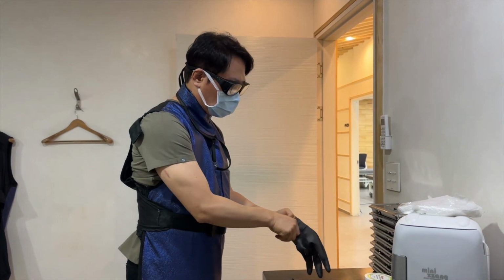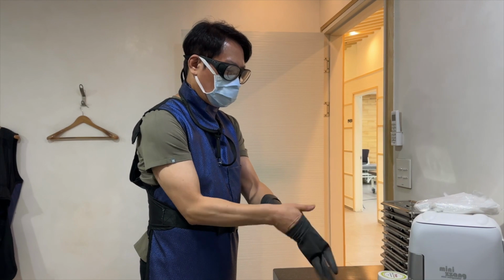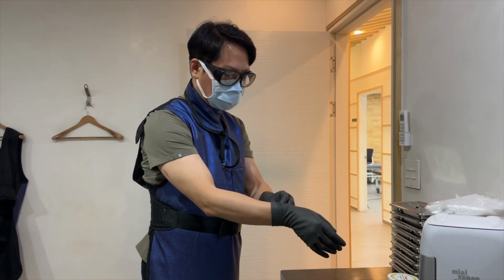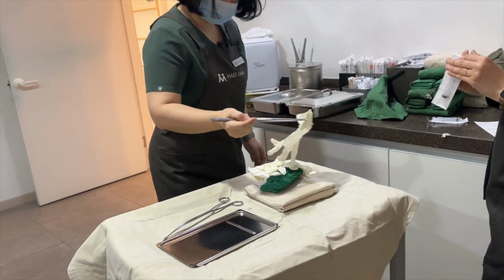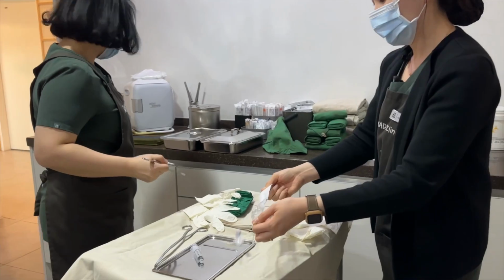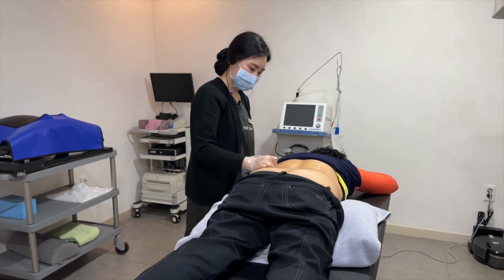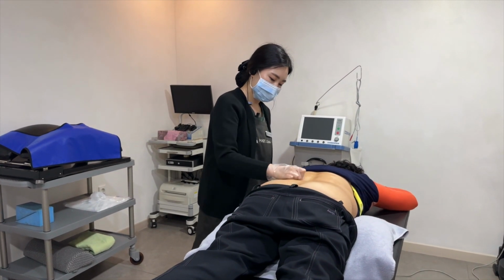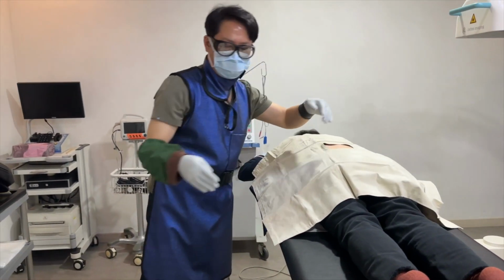It includes wearing a lead apron, lead gloves, and lead glasses. These are designed to protect the operator from radiation exposure. Finally, the maintenance of aseptic techniques is paramount to prevent infection. Operators should ensure the preparation of aseptic cloths and dressings. The surface of the surgical site should be cleaned meticulously and then dressed to maintain sterility throughout the procedure.